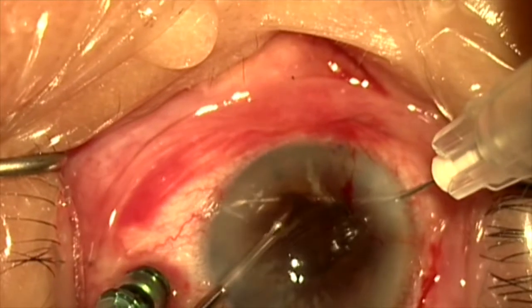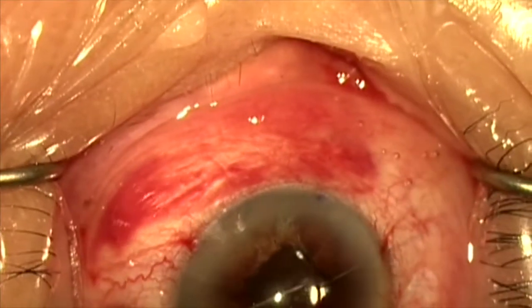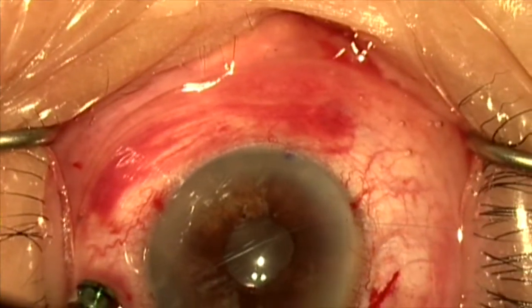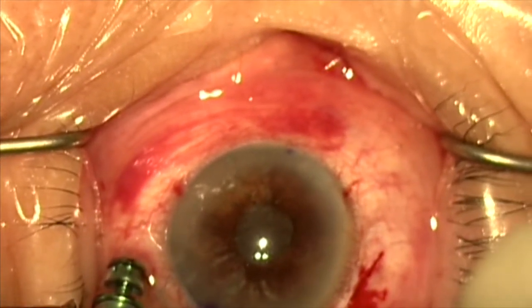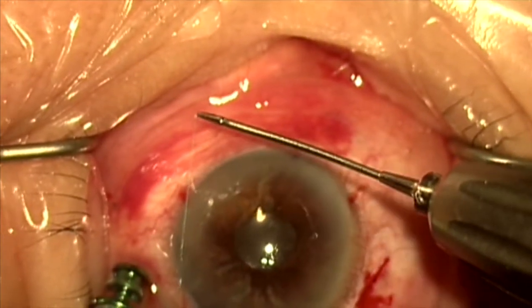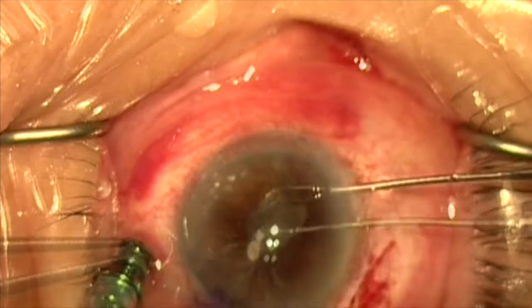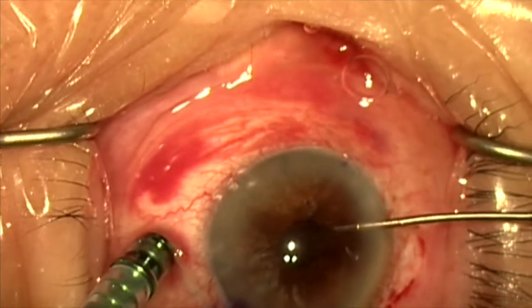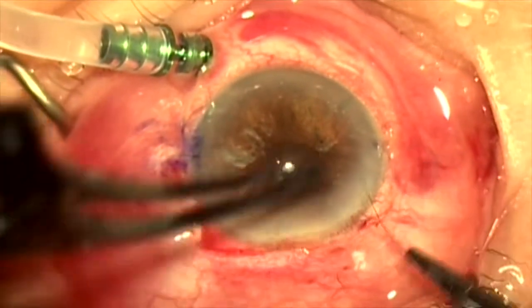After five or six passes, I'm going to grab the tip of the suture and pull it out through a paracentesis on the other side. I'll now loop the other portion of the suture out through the same paracentesis using a mini Kruglin hook. I'm going to do a single four-throw tie, cinch this knot down, and pull the knot into the anterior chamber — pulling on one side outside of the cornea and on the other side inside the anterior chamber with the micro forceps. I tighten this, cut it with a micro scissor, and the pupil repair looks very good.